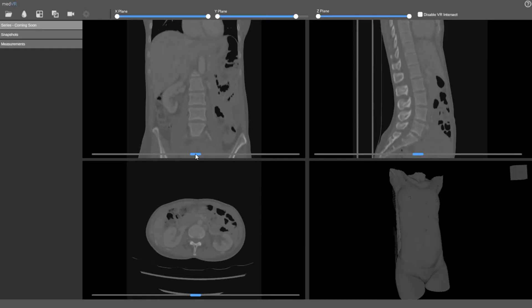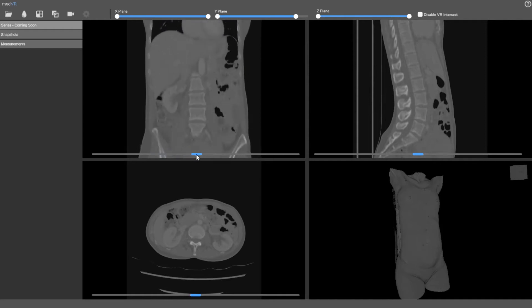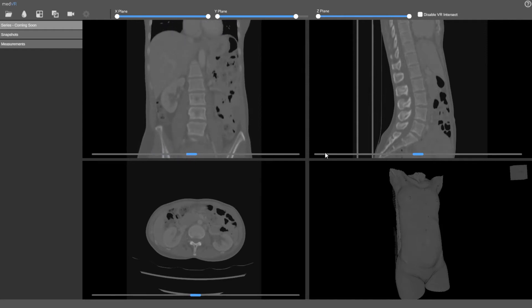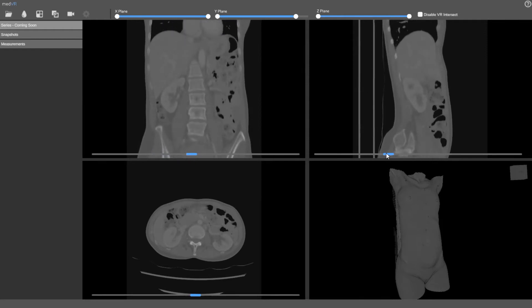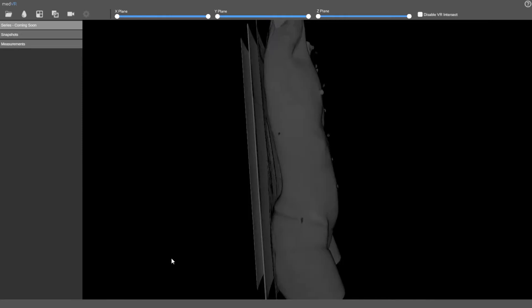So in a nutshell, what MedVR is — it's a software tool that converts traditional two-dimensional DICOM images into a virtual reality image that we can visualize using virtual reality goggles.